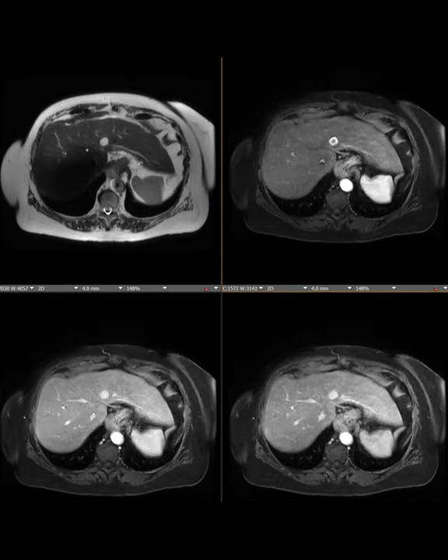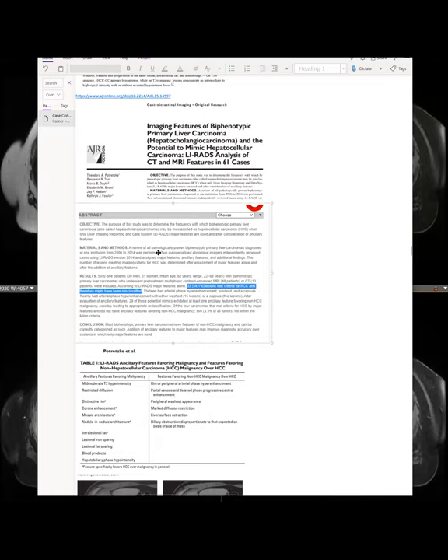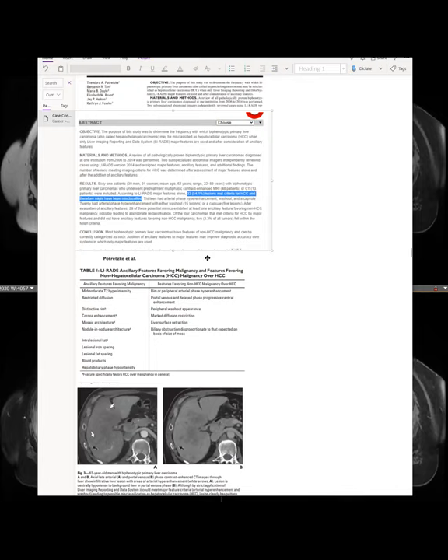We had given it an LR-M. What? I think I would have failed. I like the LR-M. Yeah, it was an LR-M. We called it prospectively. There's a study that looked at, Theodora's at Rochester, looked at LI-RADS in patients with biphenotypic mixed cholangio HCC. And they found that half of the patients had qualified for LR-5 lesions. They looked at features that separated biphenotypic from our more typical LI-RADS. And one of the things identified was the rim peripheral arterial phase enhancement, like Aarti mentioned. And then there's portal and delayed phase progressive central enhancement. And something that I think Aarti also said, marked restricted diffusion.